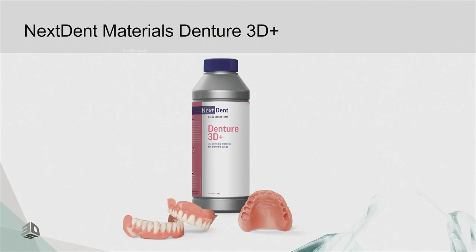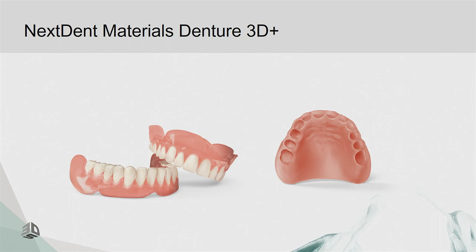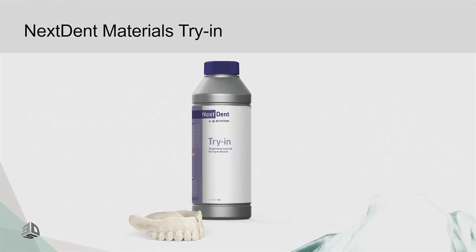And you can print your denture base, of course, after designing. After that, you can glue in the printed teeth or pre-manufactured teeth. I will talk about that in a couple of slides after this one. And you will end up with a very nice, aesthetically pleasing 3D printed denture. I'm sure that Rune is going to talk to you about that a little bit more.